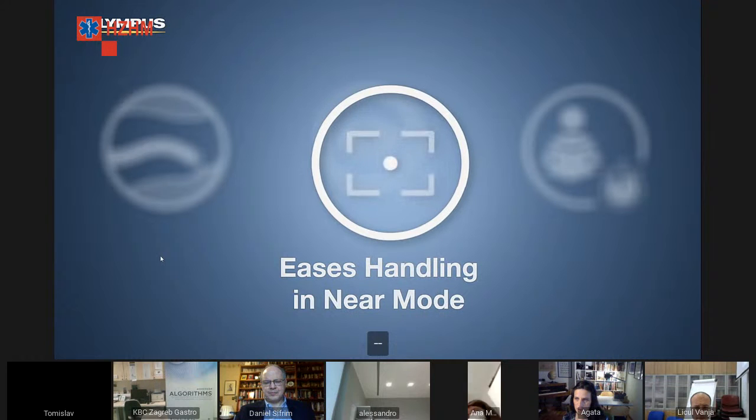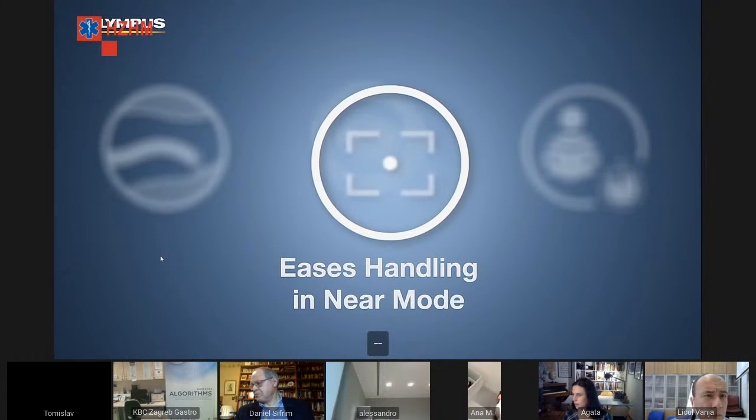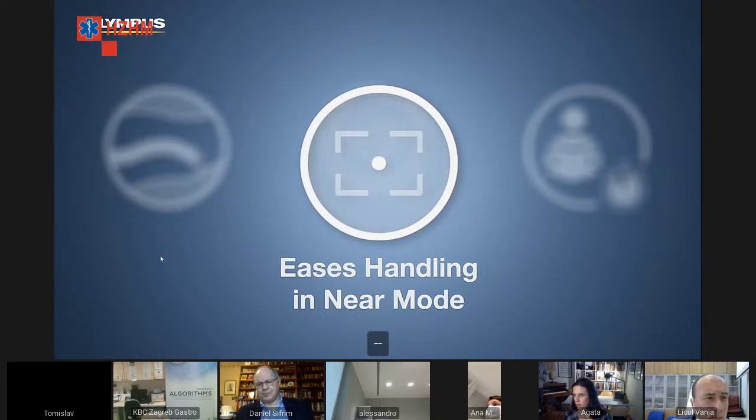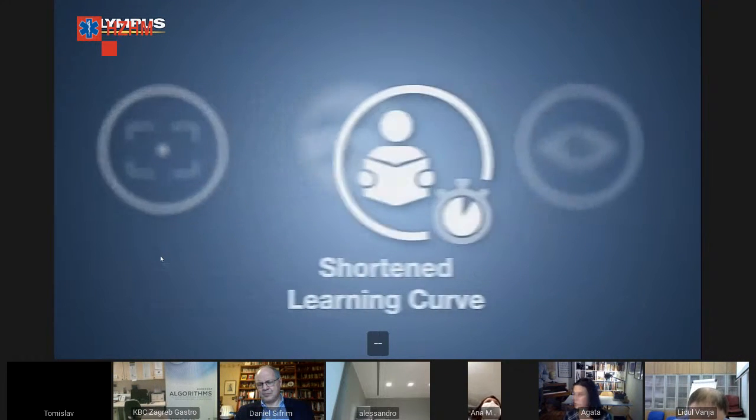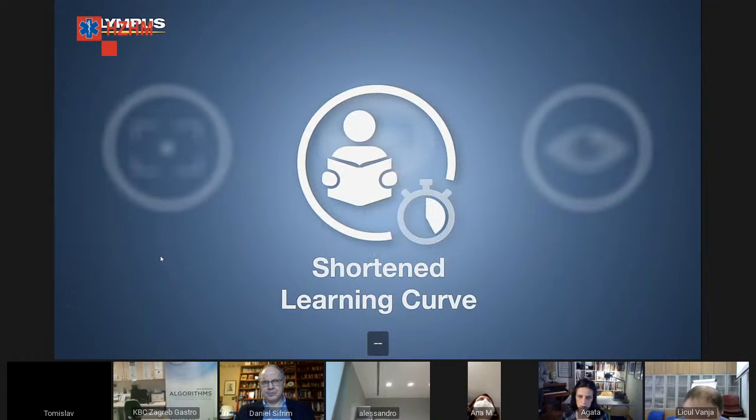With its large depth of field and maximum magnification equal to that of zoom endoscopes, it allows the entire lesion to be kept in perfect focus and images to be achieved that typically used to be reserved for very experienced endoscopists. As a result, the learning curve for advanced imaging is expected to be shortened for non-experts.